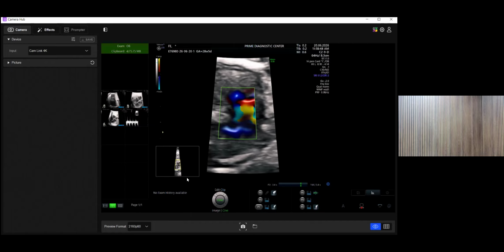Here you have no abnormality, and you are doing a fetal echo and you do 90 normal and get one abnormal fetal heart, and that is a challenge. That high-risk one also, if the findings are subtle, if you do not hunt for things or do the scanning in a proper protocol manner, you would miss it. So it's finding a needle in the haystack. But those are also the challenges of fetal echo.